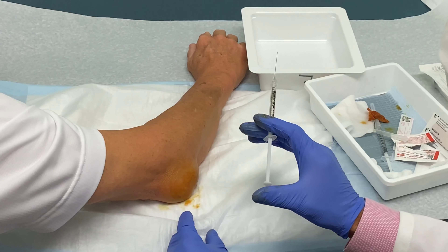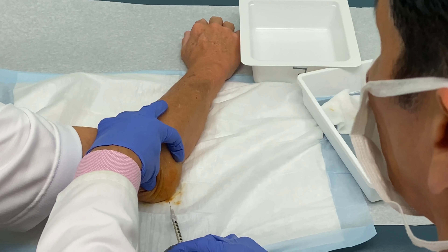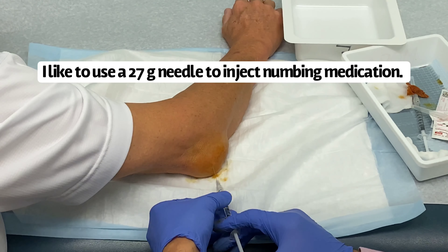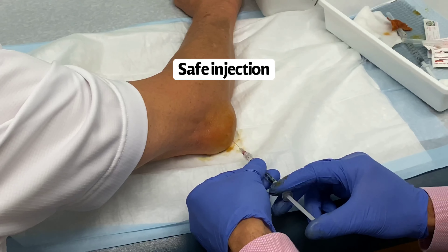It usually doesn't hurt. I'm going to give you a little lidocaine injection right here — just a little poke. There's nothing under here: no blood vessels, no nerves over this area. It's just skin.